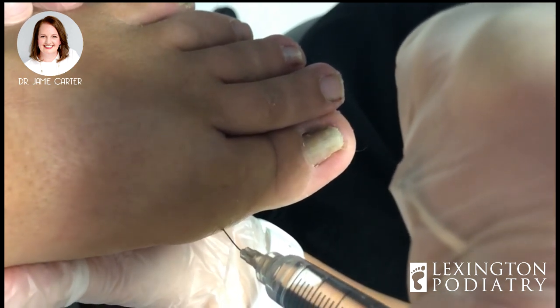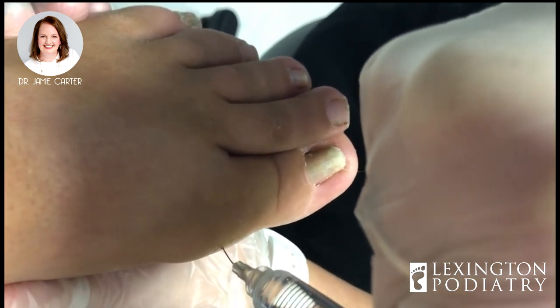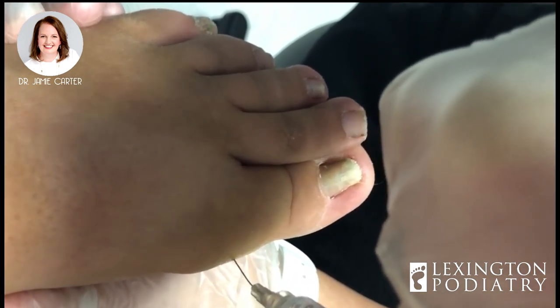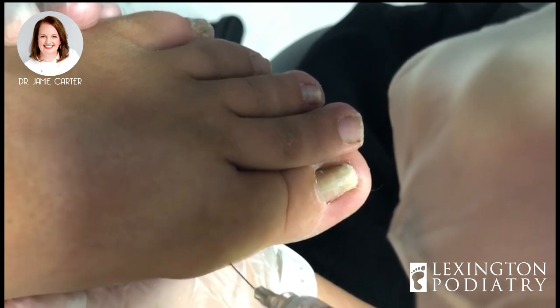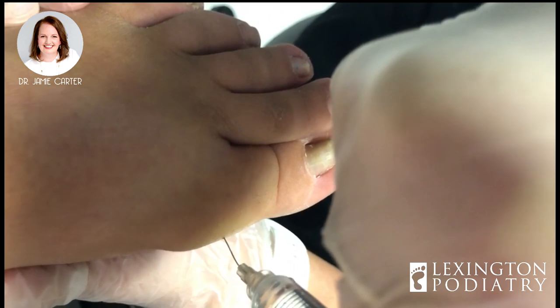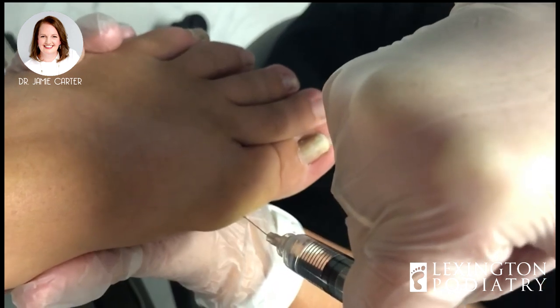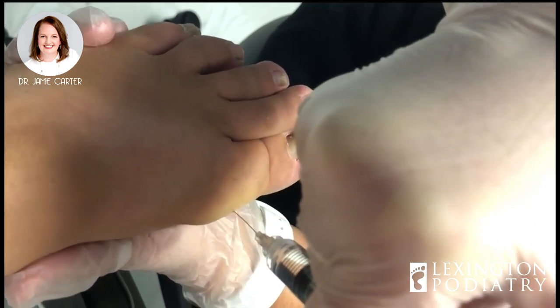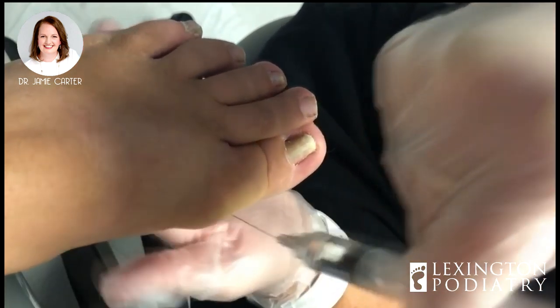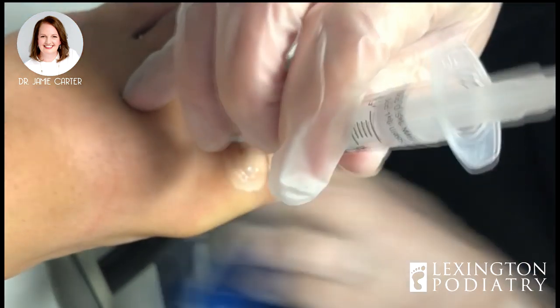A lot of doctors will actually give you four pokes at the base of the toe. I'm not a big fan of that just because I can do it in two — it's a little trick I recently learned and I think that helps to keep the patients happier in a not so happy situation. Also, we've heard horror stories of doctors actually injecting up near the toenail, and that sounds terrible to me. So here at Lexington Podiatry we would never ever do anything like that. Okay, one poke down, one more to go.